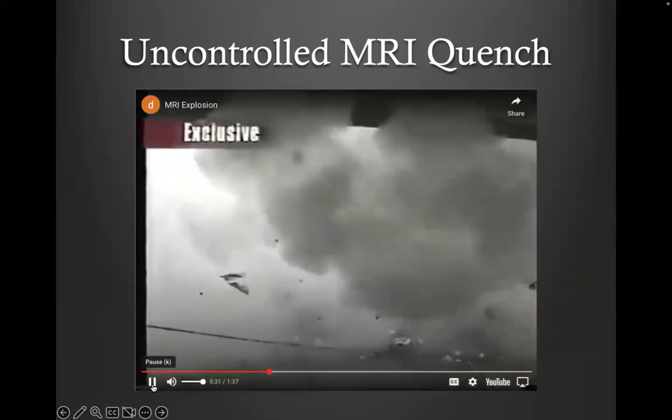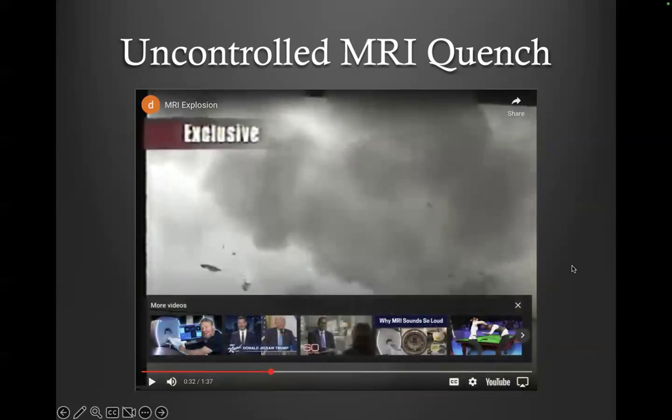So that actually changed the MRI transportation. Nowadays, you don't transport this charged up magnet. You actually install the magnet first, and then you put in liquid helium and bring it down to a superconducting condition.